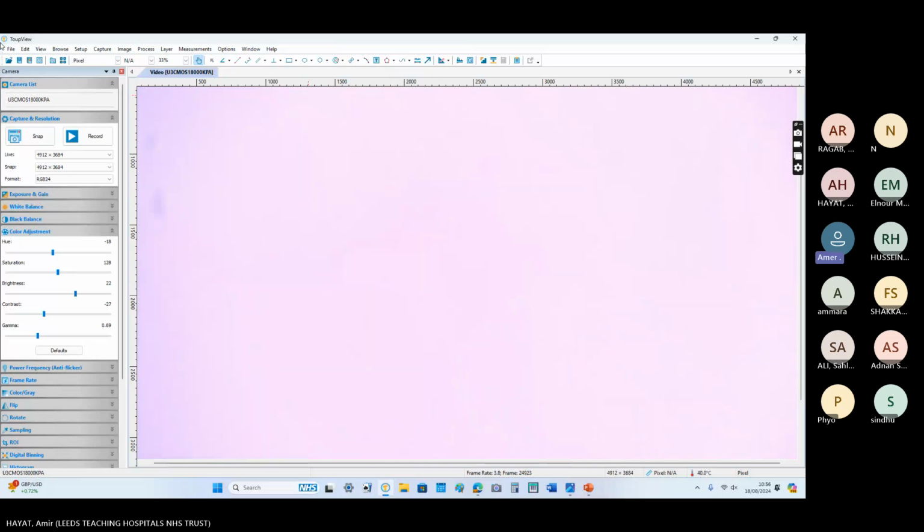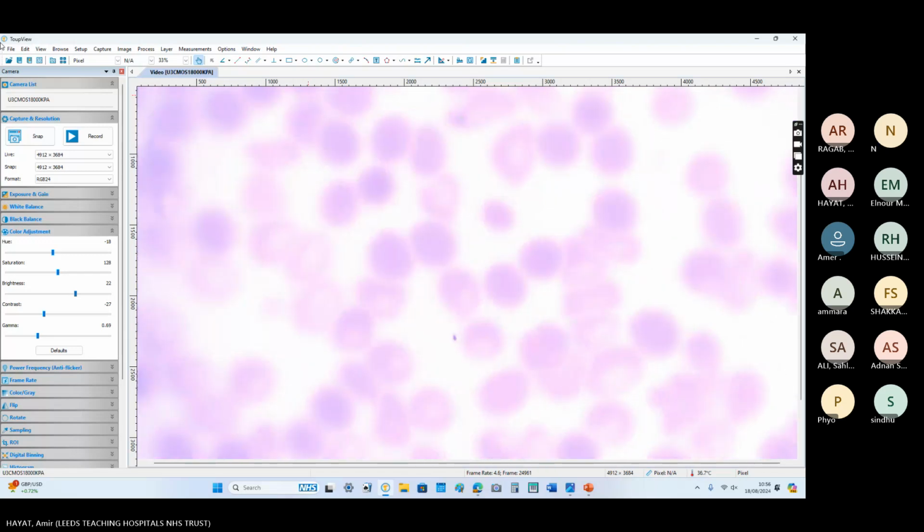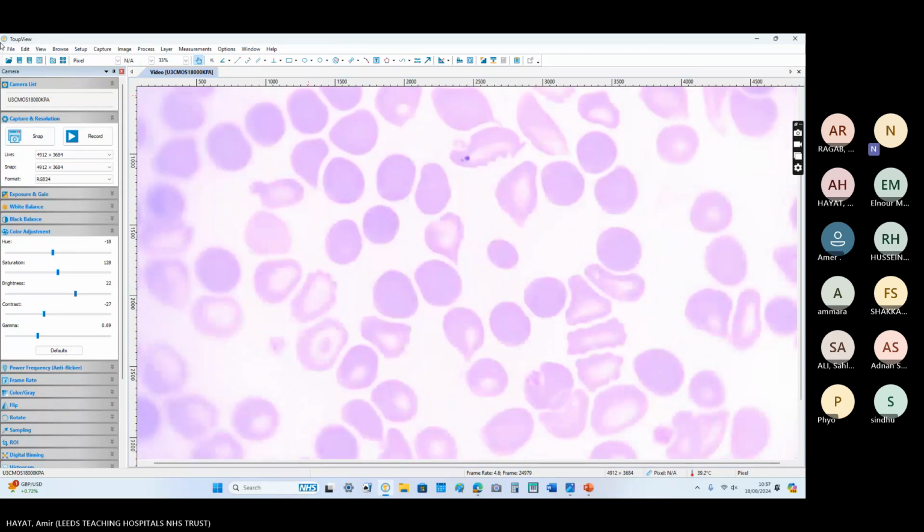HPLC and electrophoresis. No, these are the two tests. The findings are the main diagnosis. What is that? I did not get your point. I said that there is microcytosis, hypochromia, although I couldn't find any NRBCs or basophilic stippling, and although the history is consistent with the presence of some hemoglobinopathy, this blood picture is not consistent with any of them.